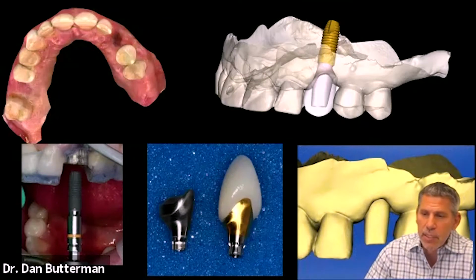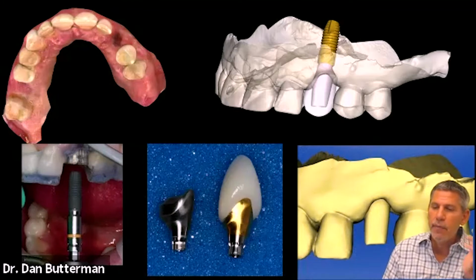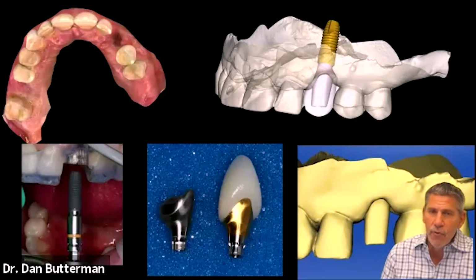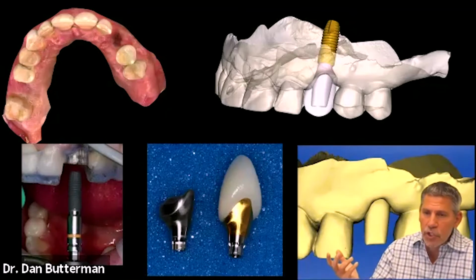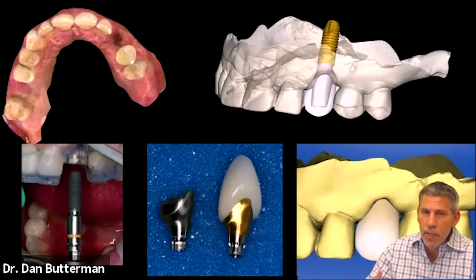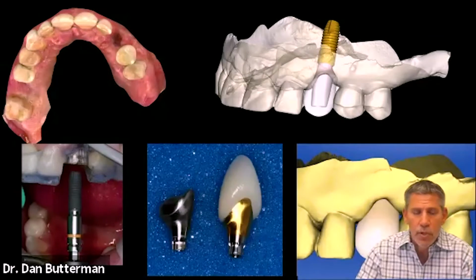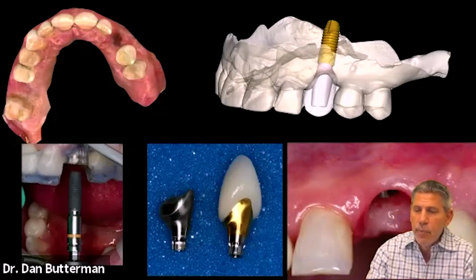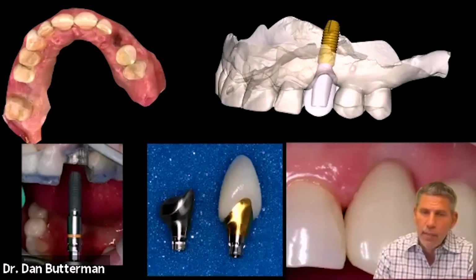Basically, this is the abutment that the patient has in their mouth. And sitting behind me here, that virtual abutment is something that I can now forward to my lab. I can say, hey, here's the abutment as if I took an impression. I want you to design a crown. So design it, mill it out, and send it to me. So now when my patient heals up and returns, all I have to do is take off their temporary and I can place my final restoration. And all of that can be done behind the scenes.